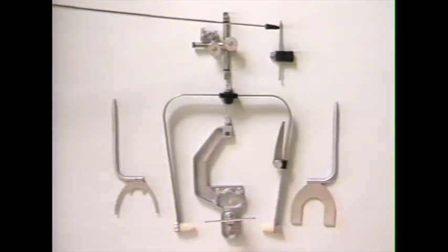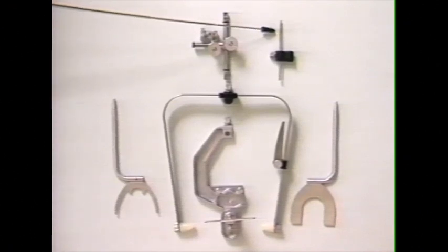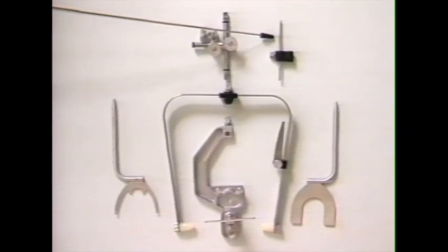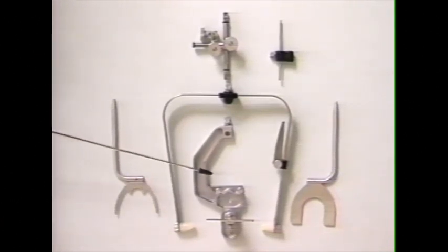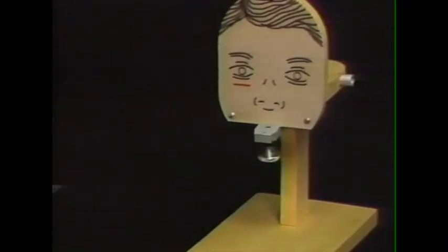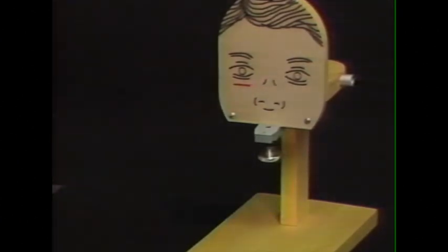This assembly here is the anterior elevator, which allows direct transfer to the articulator from the face bow, and this mounting platform with the built-in cast support, which allows mounting on the articulator without using the face bow itself. To illustrate the use of the component parts of the face bow, we're going to introduce you to Harvey, who is a mannequin set up to train individuals in the use of the face bow.